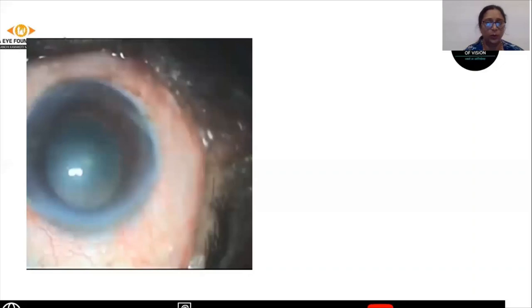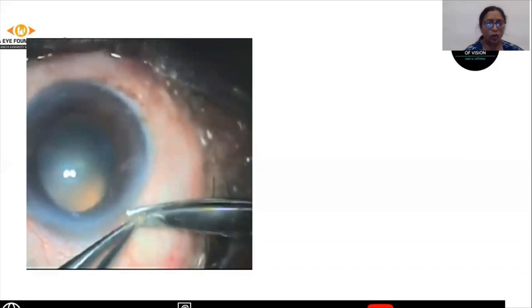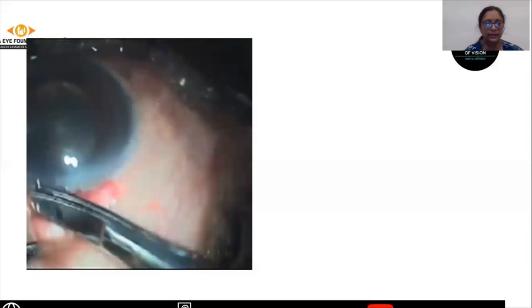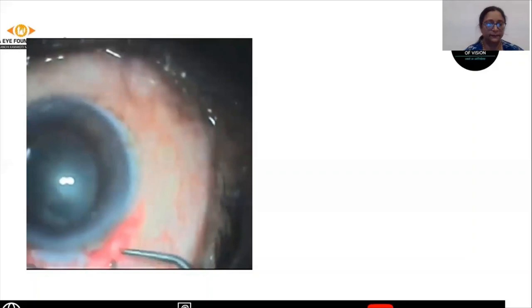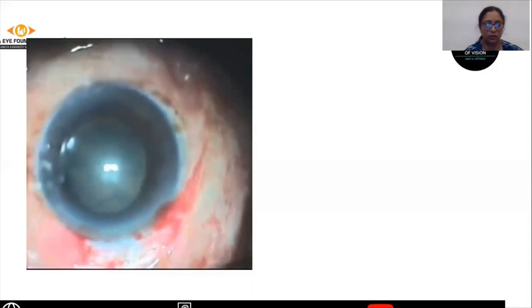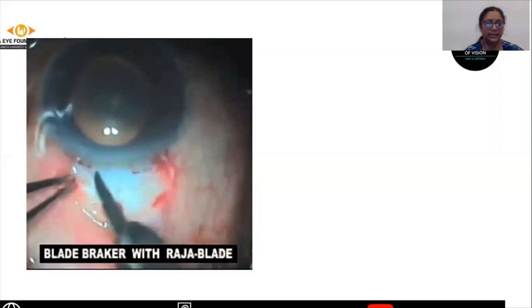Now I'll take you through the surgical video of trabeculectomy. The first step is doing the peritomy using the conjunctival scissors and the Hoskins forceps. The next step is the use of bipolar cautery. The bleeders are cauterized using bipolar cautery so that there is no bleeding into the AC or while doing the flap.